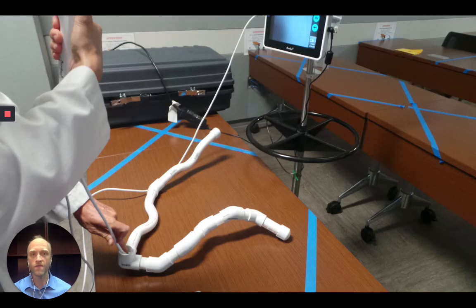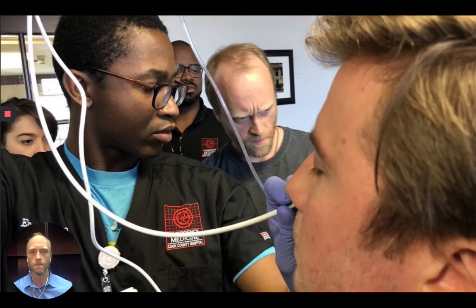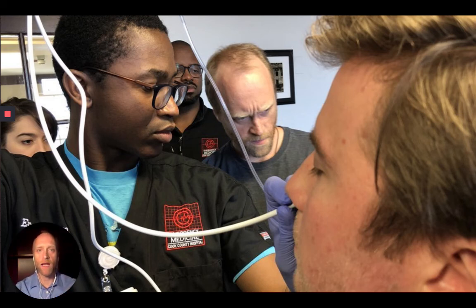I borrowed this idea from Denver Health after I saw it on their Twitter feed. You can use PVC piping to make a maze to practice manipulating the scope. The maze provides much more robust practice than just a standard airway mannequin. So after a session to familiarize yourself with the scope, the next step is to use your skills on a real person. This is also how you will gain competence in performing topicalization.